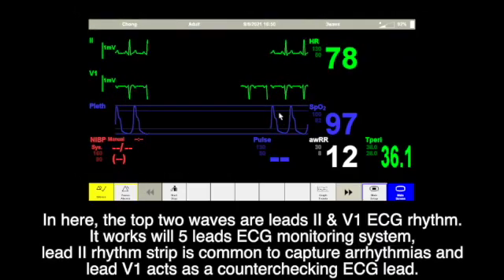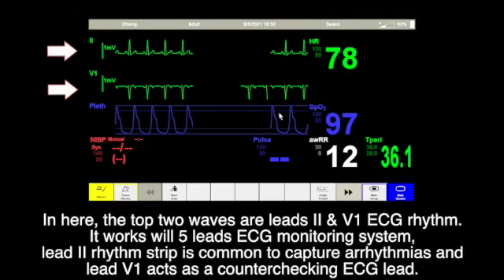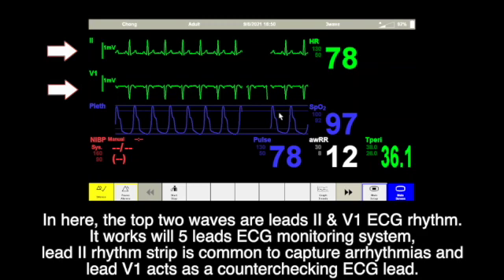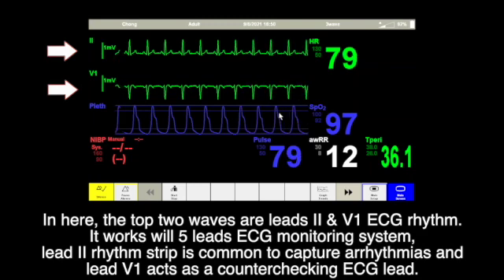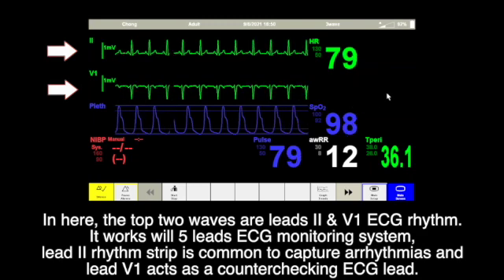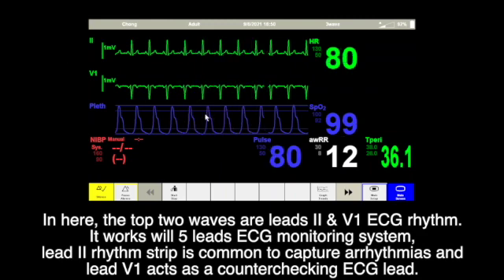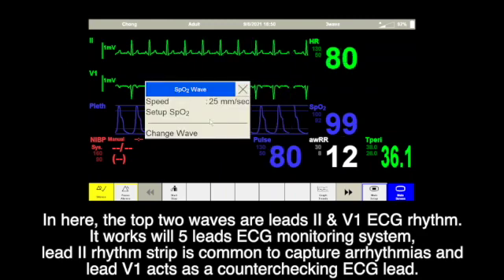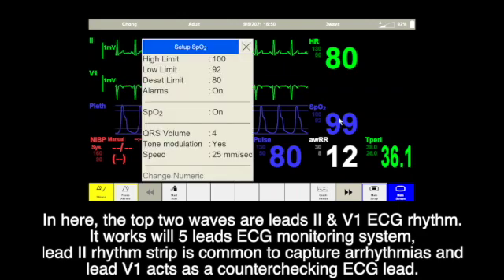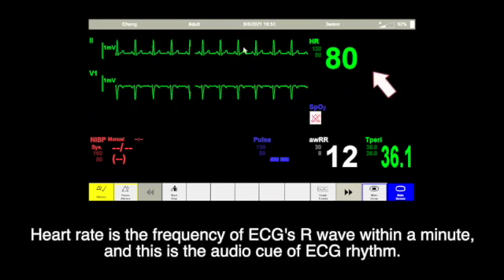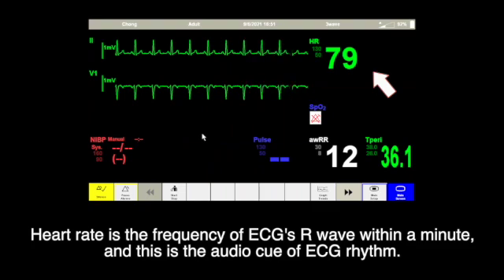In here, the top two waves are LII and V1 ECG rhythms. It works with a 5-lead ECG monitoring system. The LII rhythm strip is common to capture arrhythmia and LII V1 has a counter-checking ECG lead. Heart rate is the frequency of ECG R-wave within a minute, and this is the audio cue of the ECG rhythm.